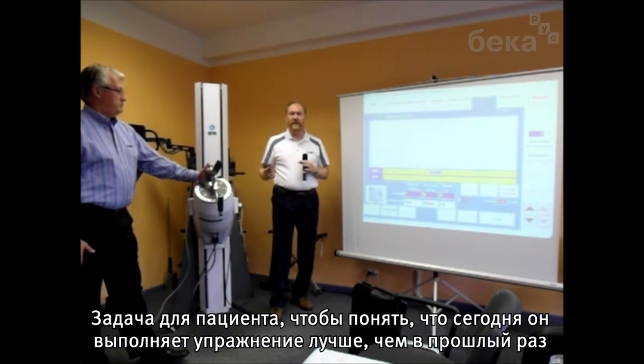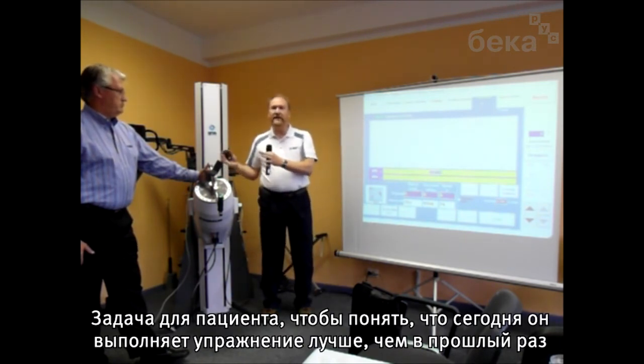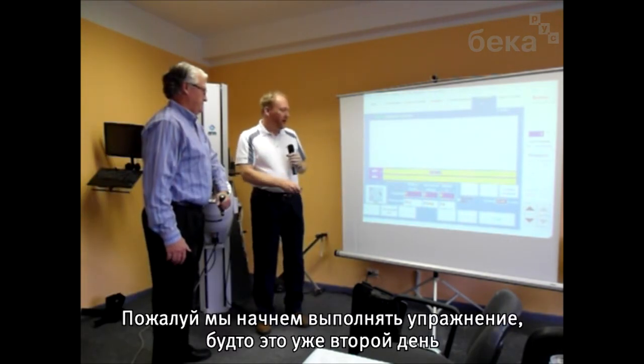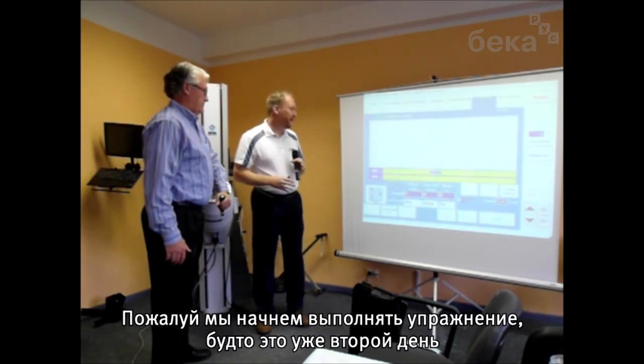So the objective for the patient, in order to ensure that he's doing better today than he did yesterday, is to try to keep his car, the race car on top, ahead of the car that's on the bottom. Okay, so we're going to go ahead and start the exercise so we can do this. We're assuming we're on day number 2 here.